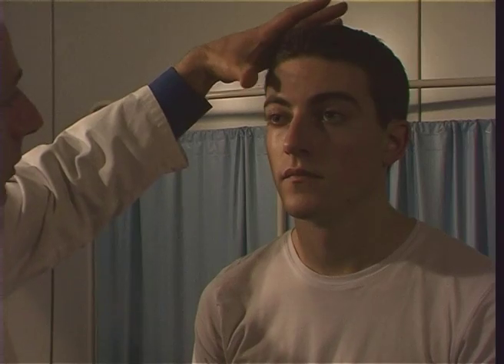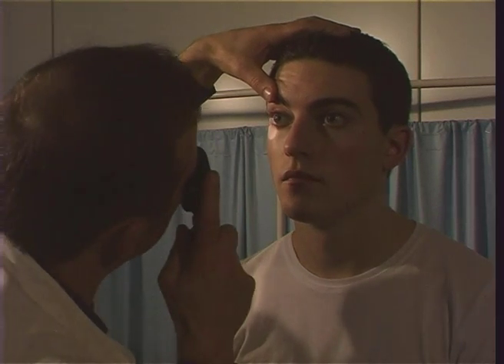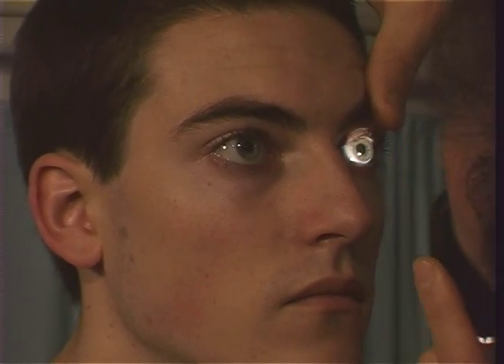It is advisable to keep your other eye open during the examination. Some practitioners prefer to steady the patient's head by placing their hand on their forehead. Students are advised to hold the patient's head with their thumb placed over the patient's eyebrow. This prevents excessive blinking by the patient but also stops you from touching their eye in the event you get too close. If you need to do this, ensure that you have the patient's permission before doing so.